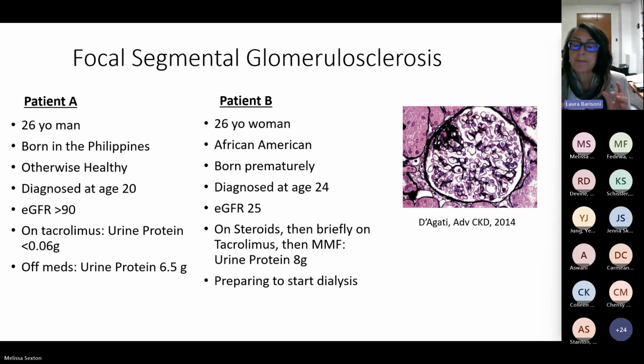Imagine that, right? And now the slides have to travel once, they get scanned, and now we have a permanent digital library of images that can be looked at by anybody, anywhere, at any time. And this is a very powerful tool.